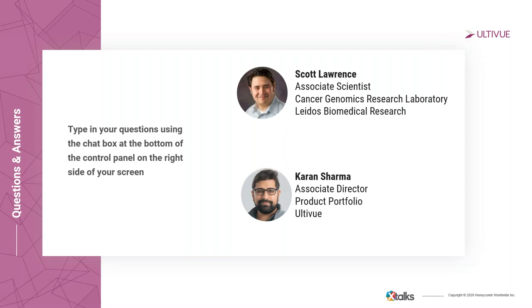One difference definitely is that signal amplification. This is important when you're looking at low expression markers and rare events that may be missed without amplification. I think in person, the Codex tool is fantastic. That's exactly, if you remember the graph we were showing, it really fits beautifully in that exploratory discovery phase where level of multiplex really matters.